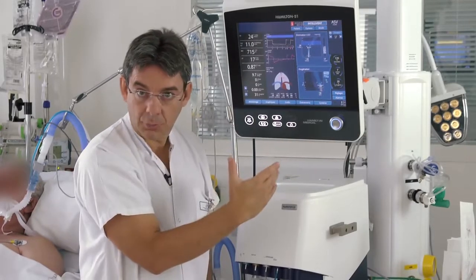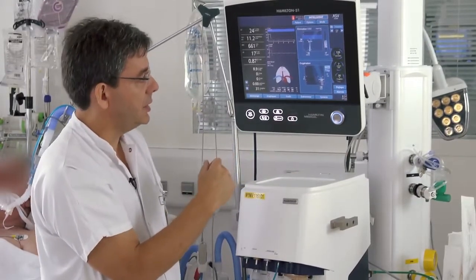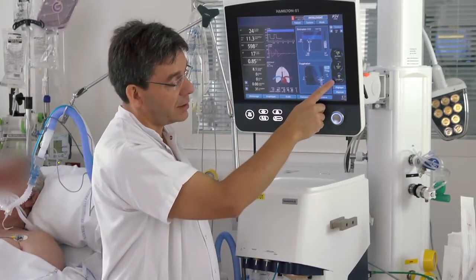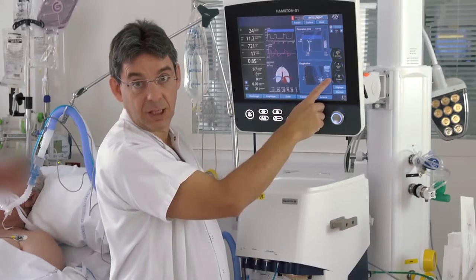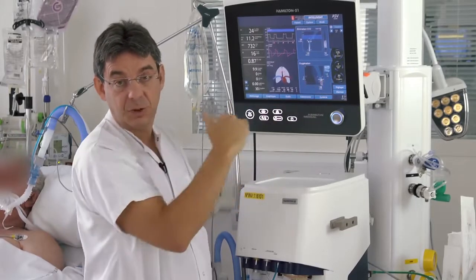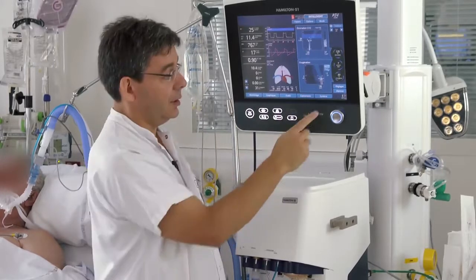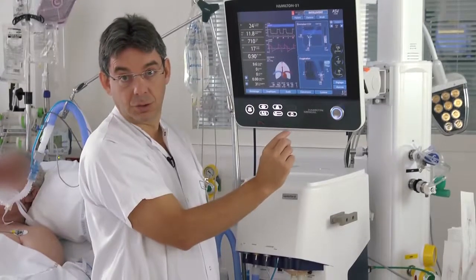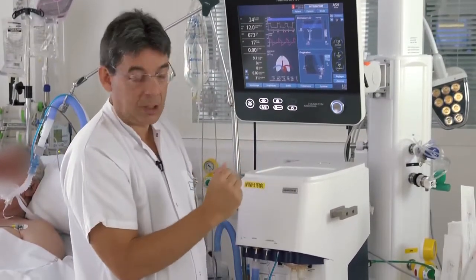When we monitor the patient, I think the most important is to check what the FiO2 is. Monitoring SpO2 is not necessary anymore because SpO2 is a target, so it will always be within the target, but the dependent value is the FiO2. So if FiO2 increases, it means that something happened and we should be careful.